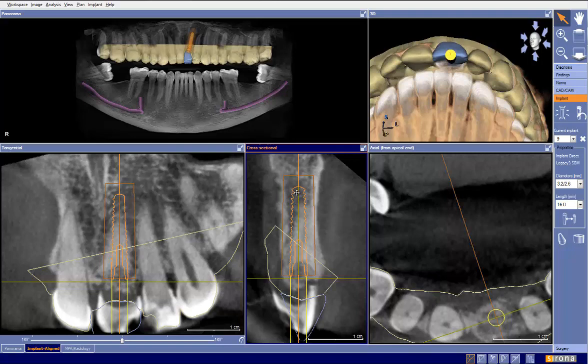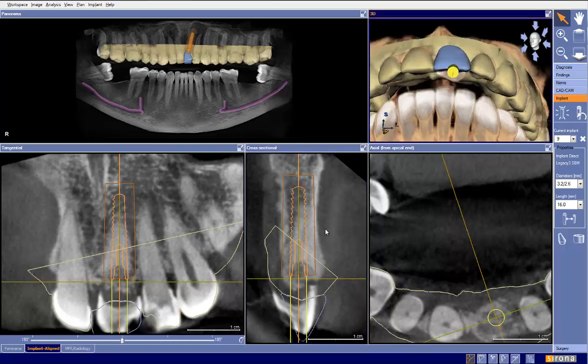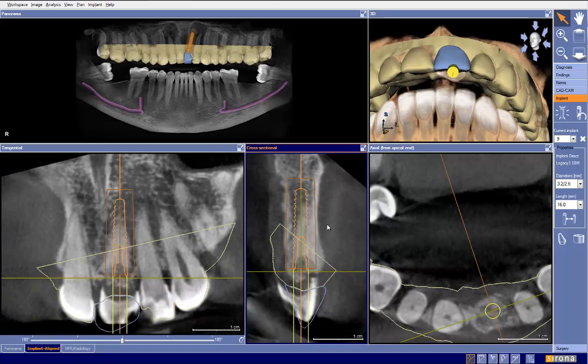If I wasn't able to achieve depth with the 2mm, then I would back out the implant, go to the next size, and try to place the implant again. I would consider maybe some osteotome bone expanders in this particular case. So there are, again, quite a few things that we have to take a look at, but the implant plan as presented was pretty well done.